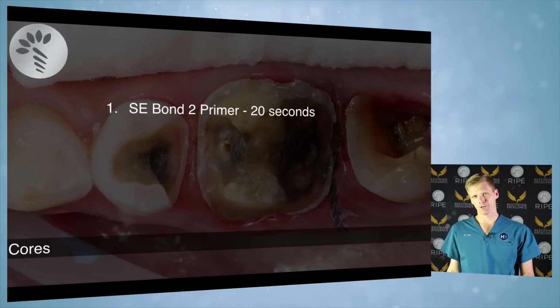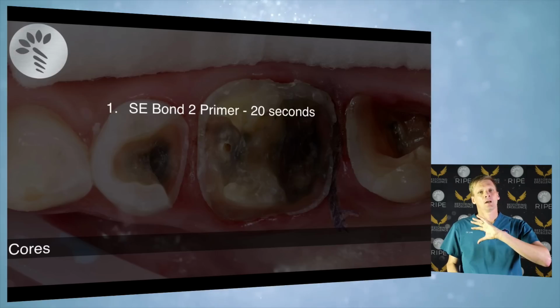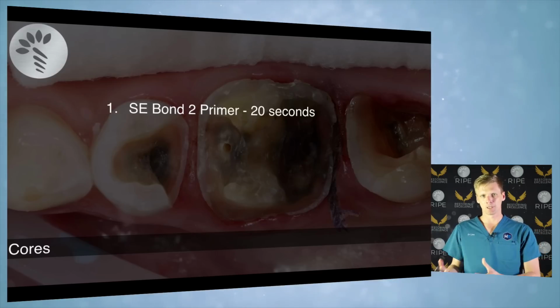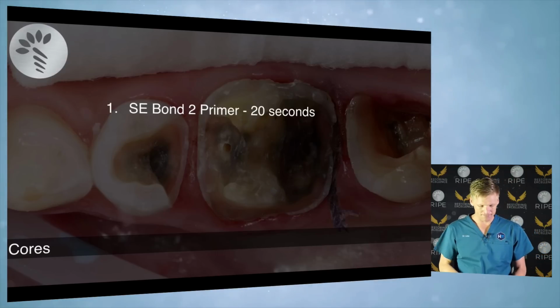I've cut off some crowns. Yes, I've had crowns break, and I've cut them off, and the core was still intact, and it was still very retentive. The core shouldn't fall off when you prep, okay? There's a problem with your bonding if you take an impression and the core falls off, or if you take your temporary off and the core falls off.